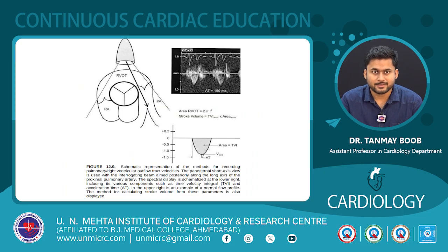As shown in the figure, we can calculate velocity time integral, multiply it by area, and thus we can calculate the stroke volume and the cardiac output.